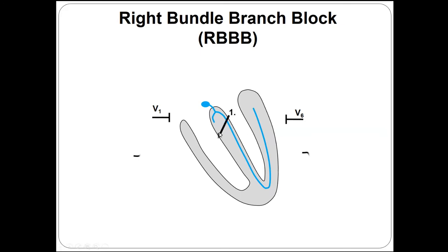That's because of the septal activation. The septum is activated from the left bundle, which is intact, and this goes from left to right. This is why you have positivity in V1 and negativity in V6, because it goes away from the left, toward the right. So it is only related to the direction of the vector? Yes, that's it.